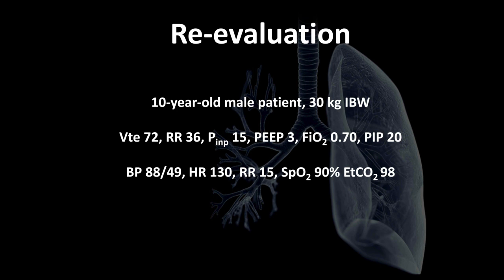And if you learn like I did as a new paramedic and we started using end-tidal CO2, you're taught in a very basic way. If your end-tidal CO2 is high, if you're hypercapnic, it's because you're not breathing fast enough. Your minute ventilation is not adequate enough. And so we're taught to do what? We're taught to speed up our rate. In contrast, if you're hypocapnic, if your respiratory rate is super high, your end-tidal CO2 is correspondingly low, we're taught to slow down our rate. And I really, really caution you to forget that teaching. That should be probably the fourth or fifth thing that you consider.